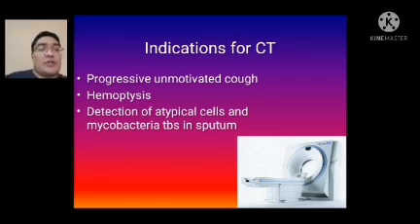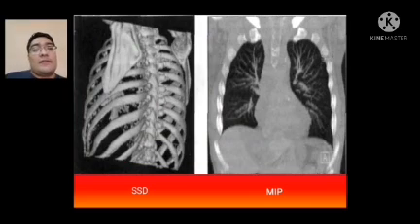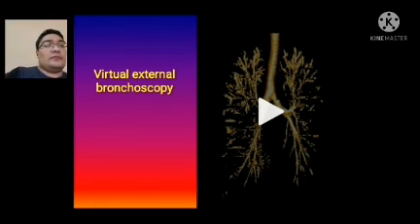So this is the CT scan machine. You can see it. So, CT methods. Please pause and write them down. From the left side, we can see the 3D image of bones by CT scan. Why is it needed? For the accurate diagnostics of fractures, dislocations of bones, etc. Here we can see a 3D reconstruction of the bronchi. Of course, we can see where the passageway is not clear, and where the branches are going, etc.